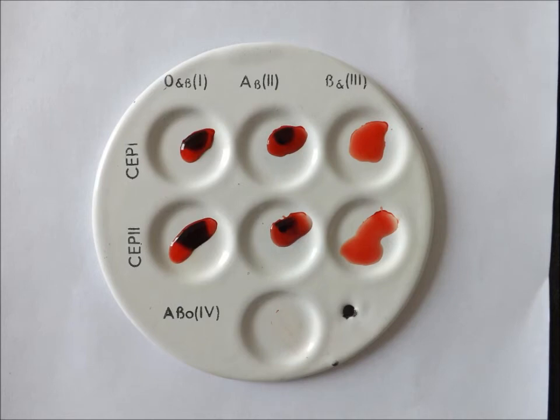If there is agglutination with the serum of the first and second blood groups, then the blood group is the third. If there is agglutination with the first and third serums, then the blood group is the second. If there is no agglutination, then the blood group is the first.